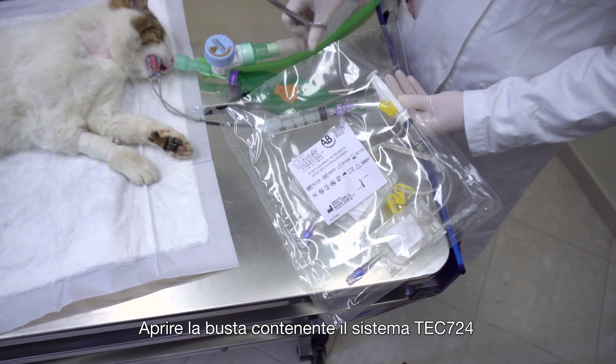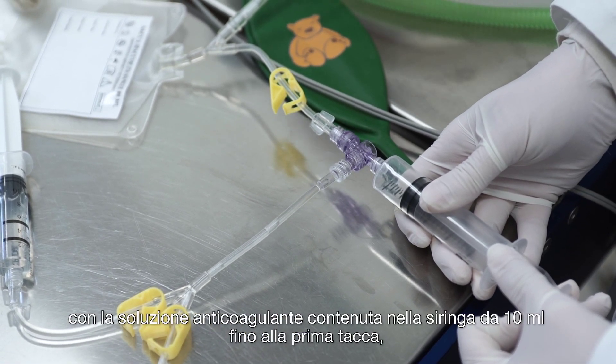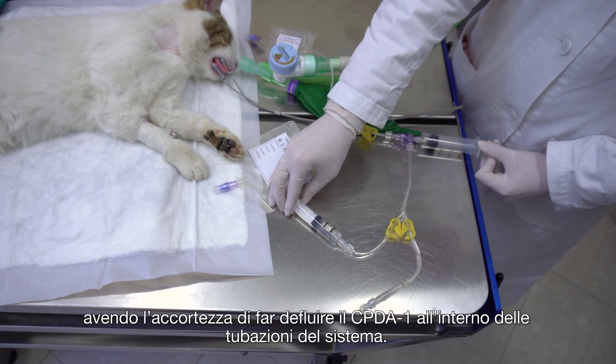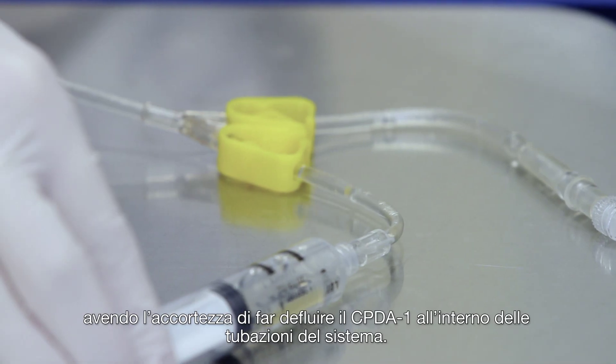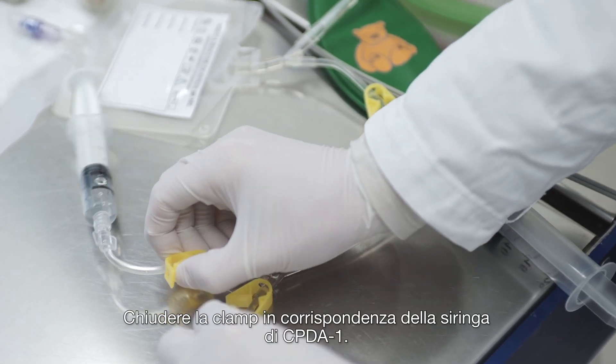Open the blister containing Tech 724 and push the plunger of the 10 ml syringe containing the anticoagulant solution up to the first line, making CPDA-1 flow into the tubing. Close the clamp beside the CPDA-1 syringe.